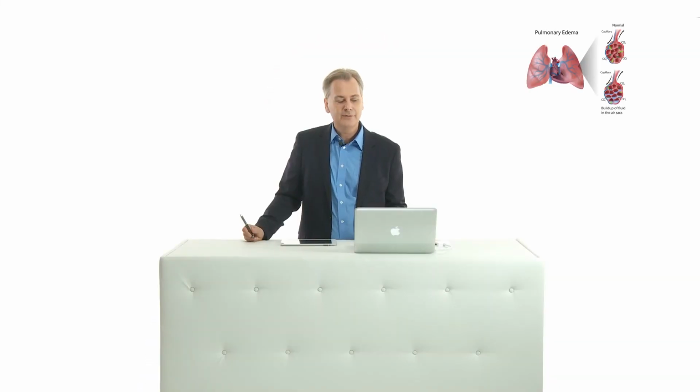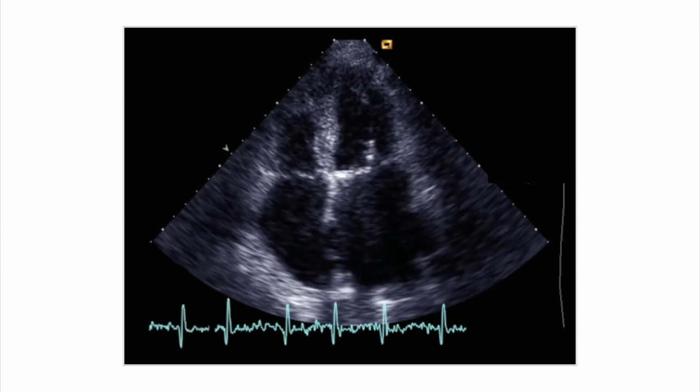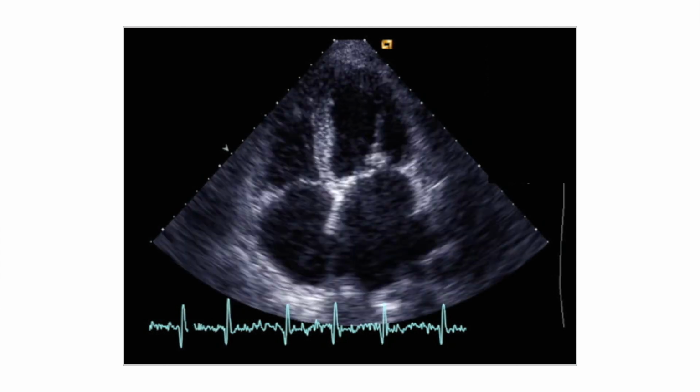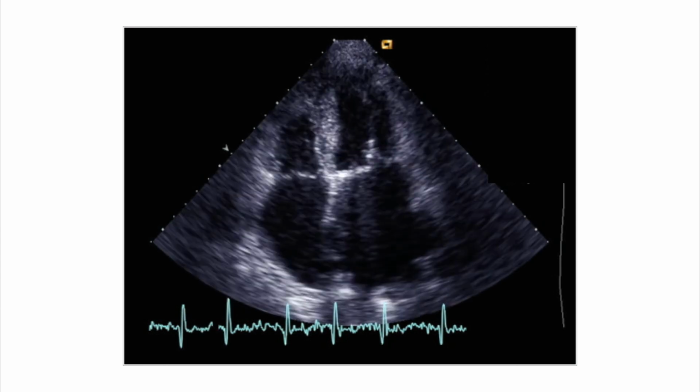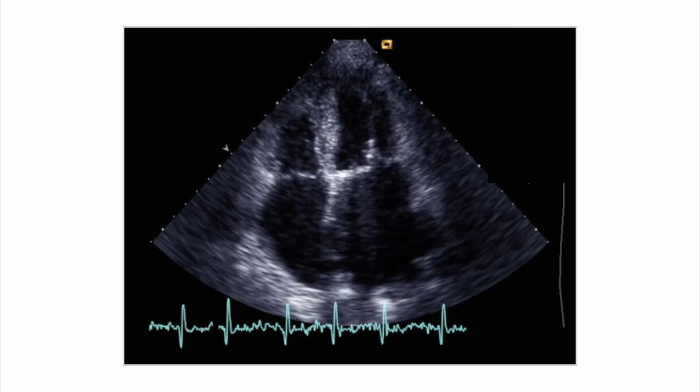You have to know that patients with mitral stenosis can develop pulmonary edema very, very quickly. It can go within minutes. And the reason is, as I mentioned previously, that the obstruction to inflow causes elevation of left atrial pressure. Here you see that the left atrium is very large, and it translates to the pulmonic circulation.